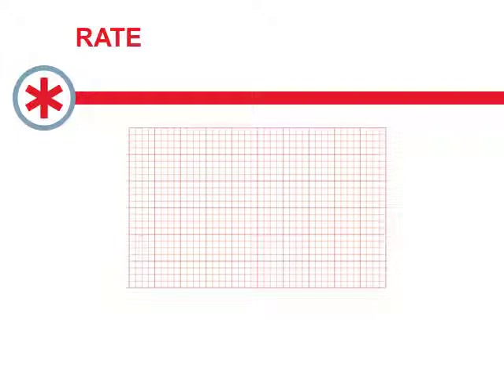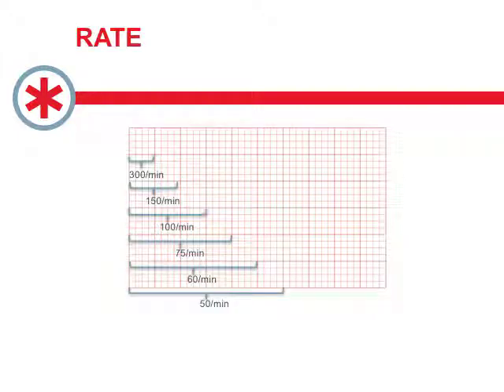And the first one is that the ECG actually calculates a heart rate for you, and the ECG machines actually do a really wonderful job at this. So that's usually the first thing I look at, and that's usually almost good enough for just about anyone. Having said that, there is certainly this very rapid way to have a peek at heart rate, and I'll use it just to eyeball things and make sure that the readout on the ECG is actually reasonably accurate.